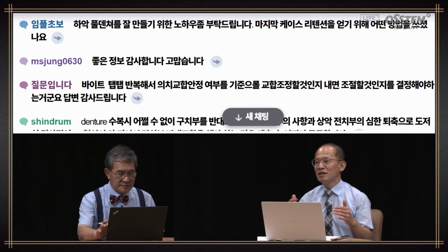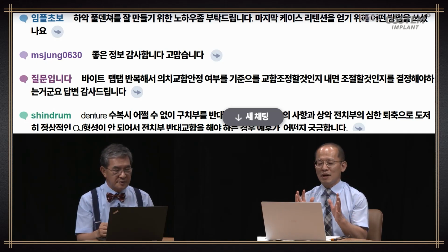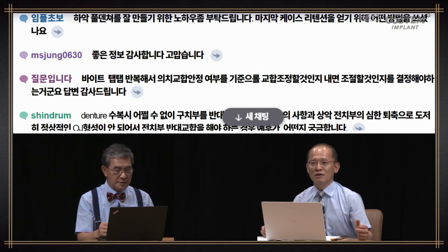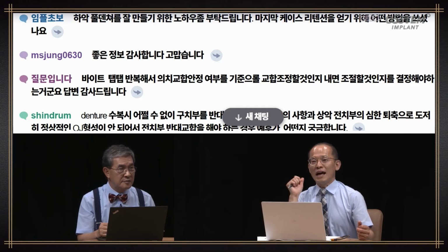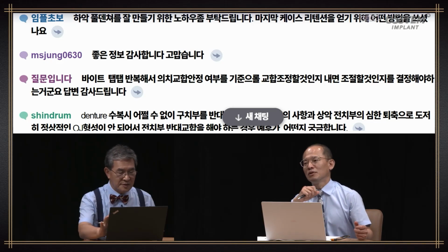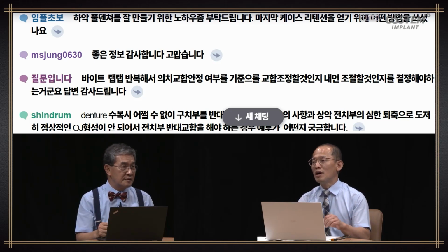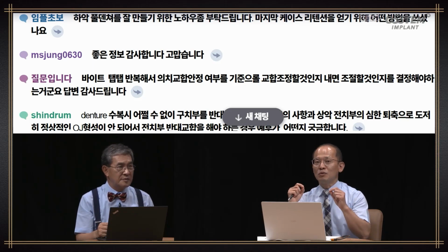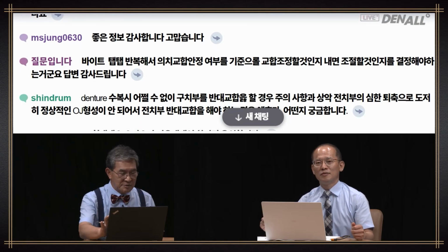Whatever the patient, this is the form of the mandibular denture that I need to create. And with that, you need to adjust slightly for the patient. For the last case, retention was about stability of the occlusion. There's not much retention. It's not something that I can create. You need the good appearance. If the patient is comfortable, then with the stability, you have it. And stability is key for chewing. That's how you need to understand it.